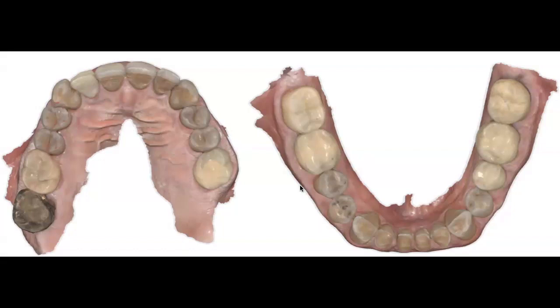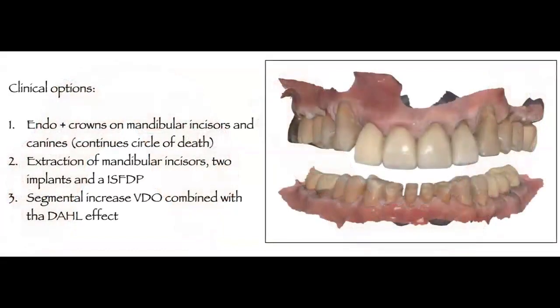But you can see how aggressive this ceramic restoration that has lingual coverage is compared to the veneers that the patient has on 7 through 9. This ceramic restoration has created this excessive attrition and erosion on the incisal facial aspect of tooth number 26. So when you have ceramic and an improper envelope of function restored on a patient, you are going to see this type of wear. And at this moment, you have to ask yourself, what are my clinical options? What can I do in order to restore this stomatognathic system back to function?